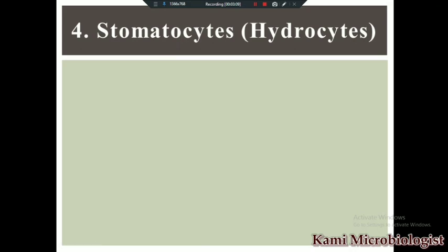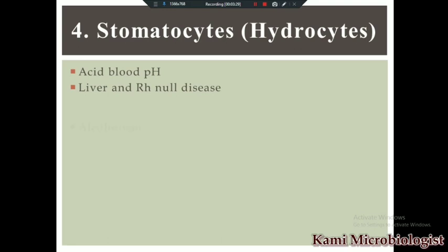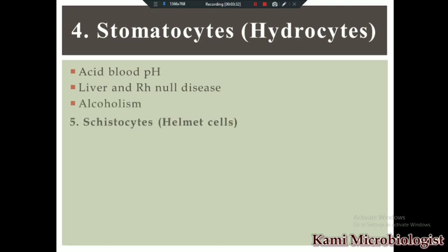Next we have stomatocytes, also called hydrocytes. Stomatocytes or hydrocytes occur in different conditions: acidic blood pH, liver disease, Rh-null disease, and alcoholism. These are the three main conditions in which stomatocytes or hydrocytes will be present.